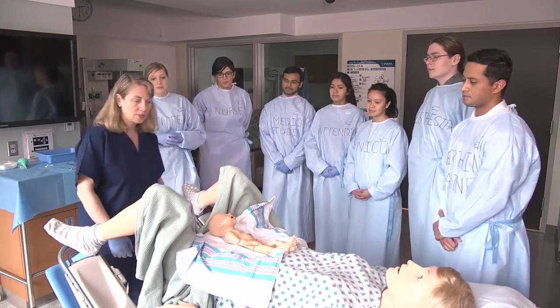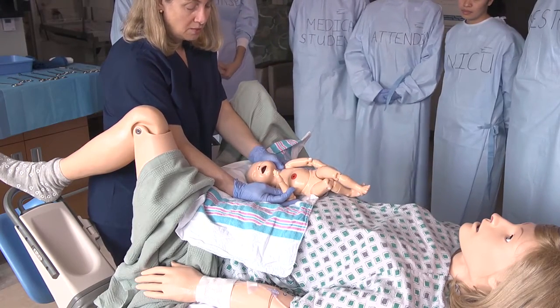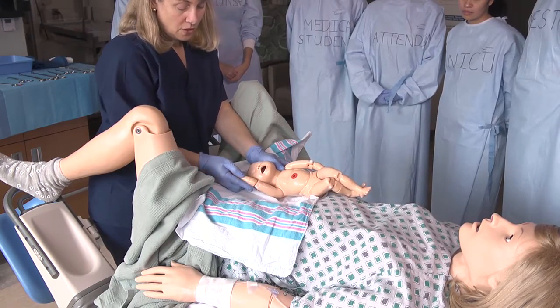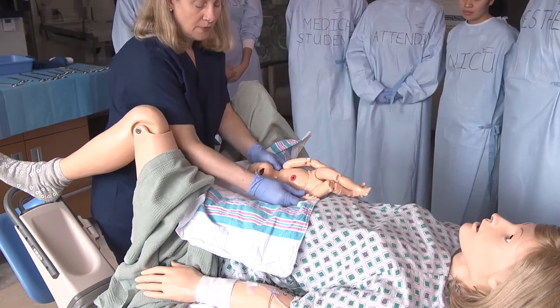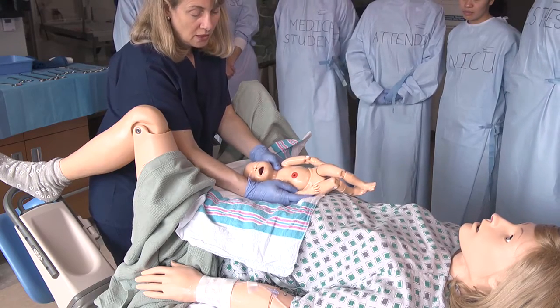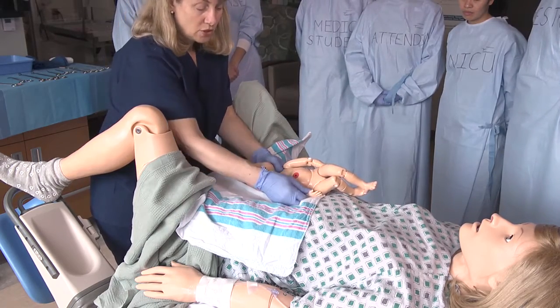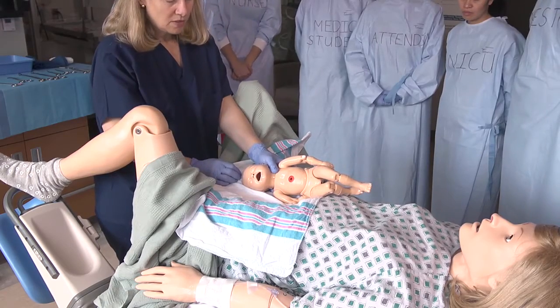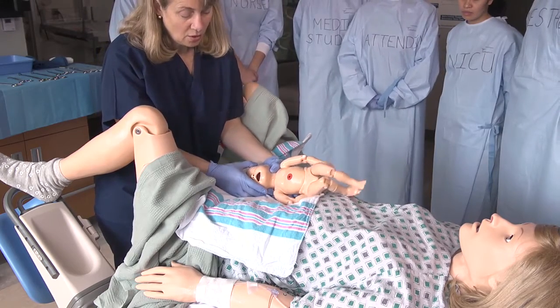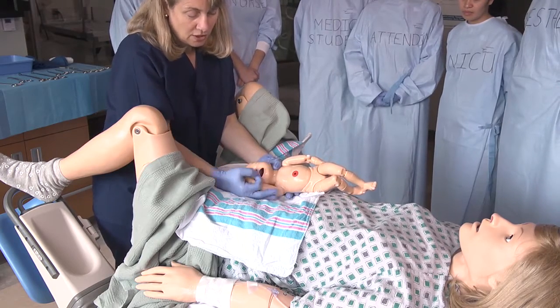Let's talk about the posterior arm skills right now. The baby can place its arm in three different positions. The first, and easiest, is where the baby's arm is bent — you slide your hand in, grasp the baby's forearm, and deliver it across the chest. The second position is if the arm is on its side — you reach in a little deeper, place your thumb in the antecubital fossa, and deliver the forearm up into your palm and across the chest. The third and most difficult position is where the baby's arm is behind its back — you insert your fingers and gently drive the humerus forward so you can place your thumb in the antecubital fossa and bring the arm up across the chest to deliver it.